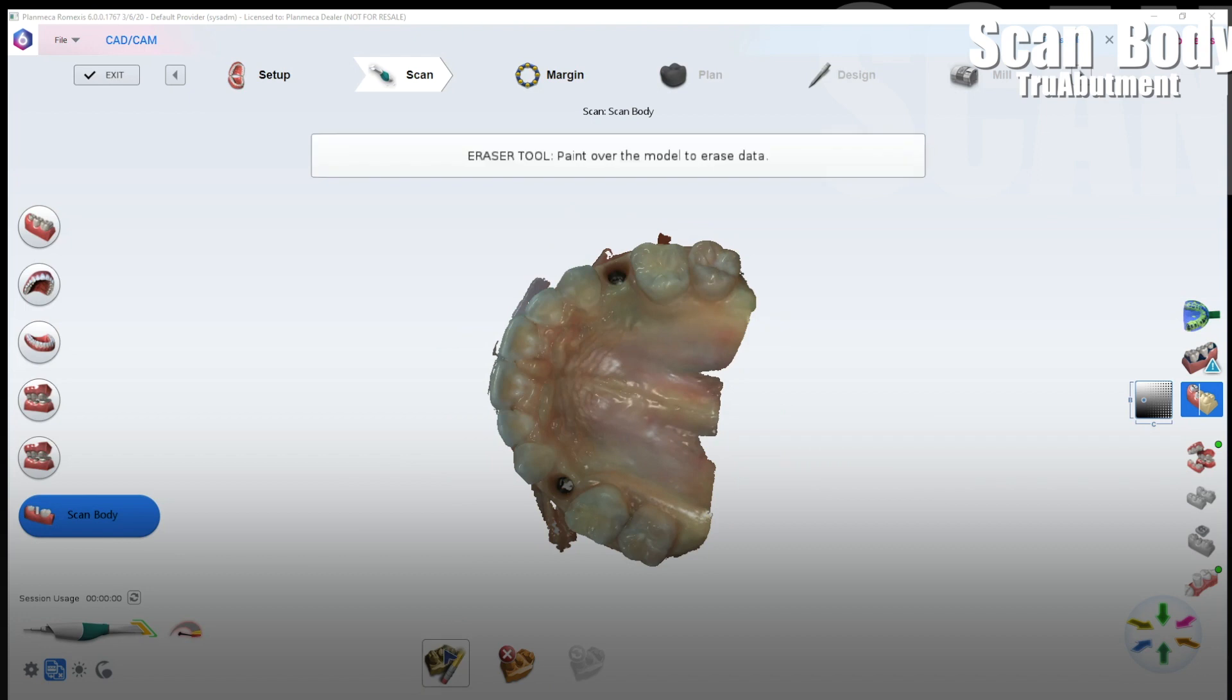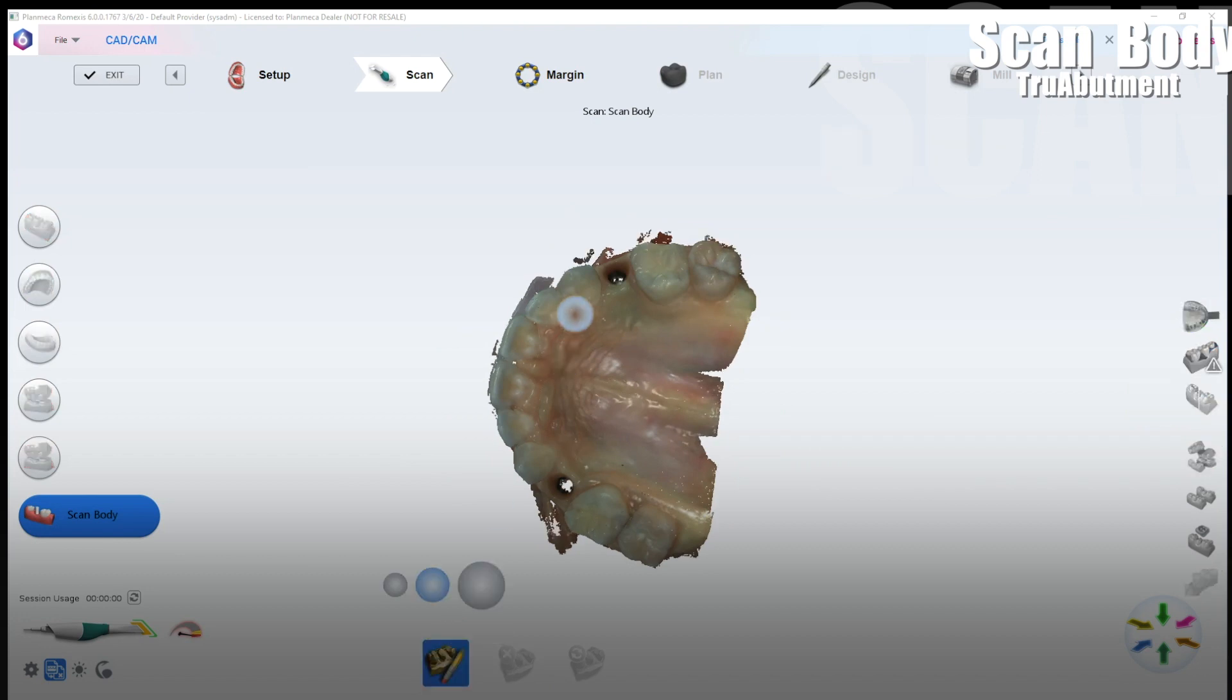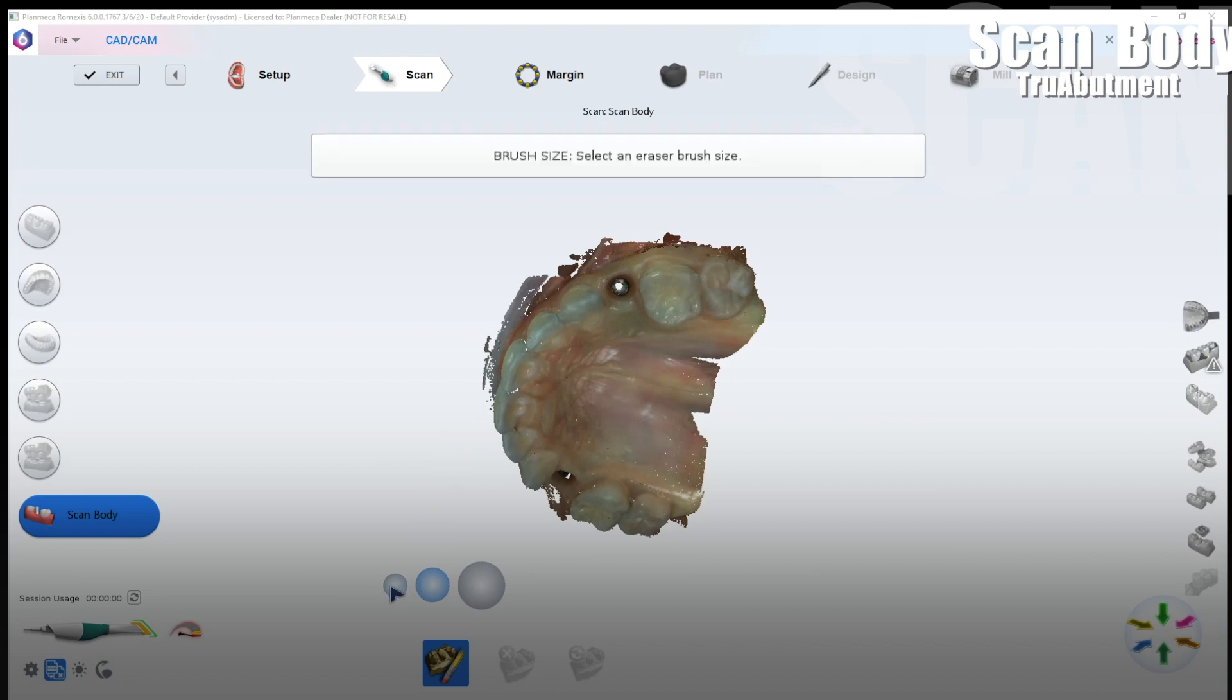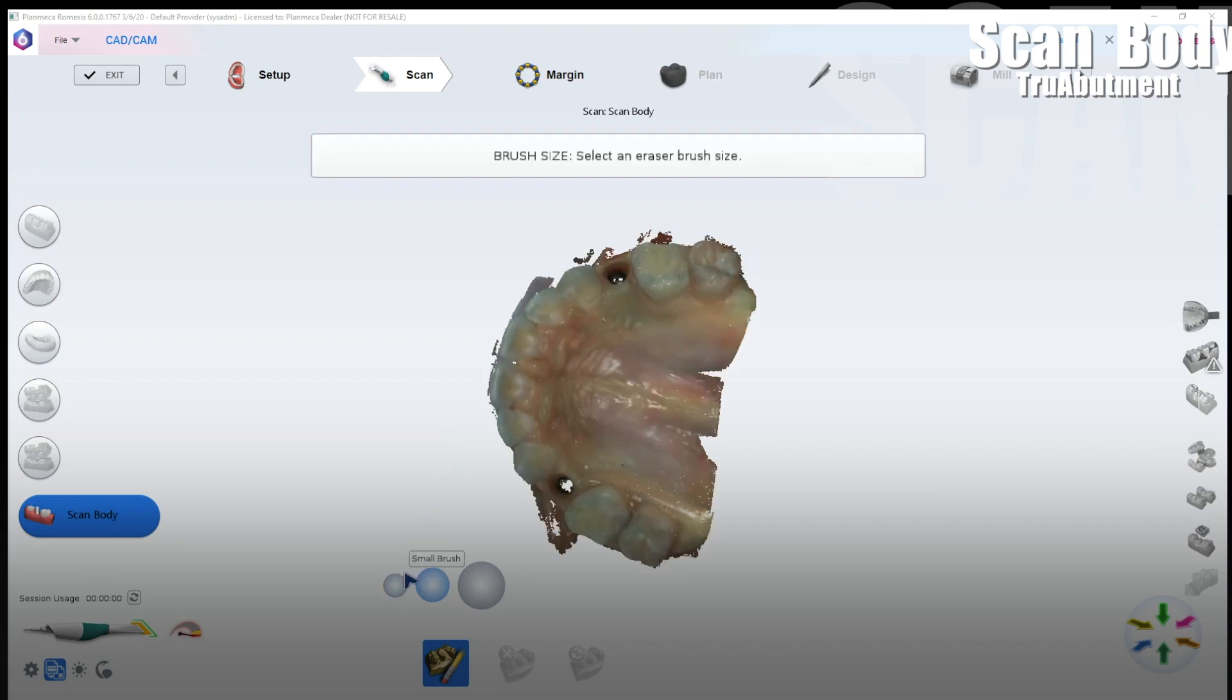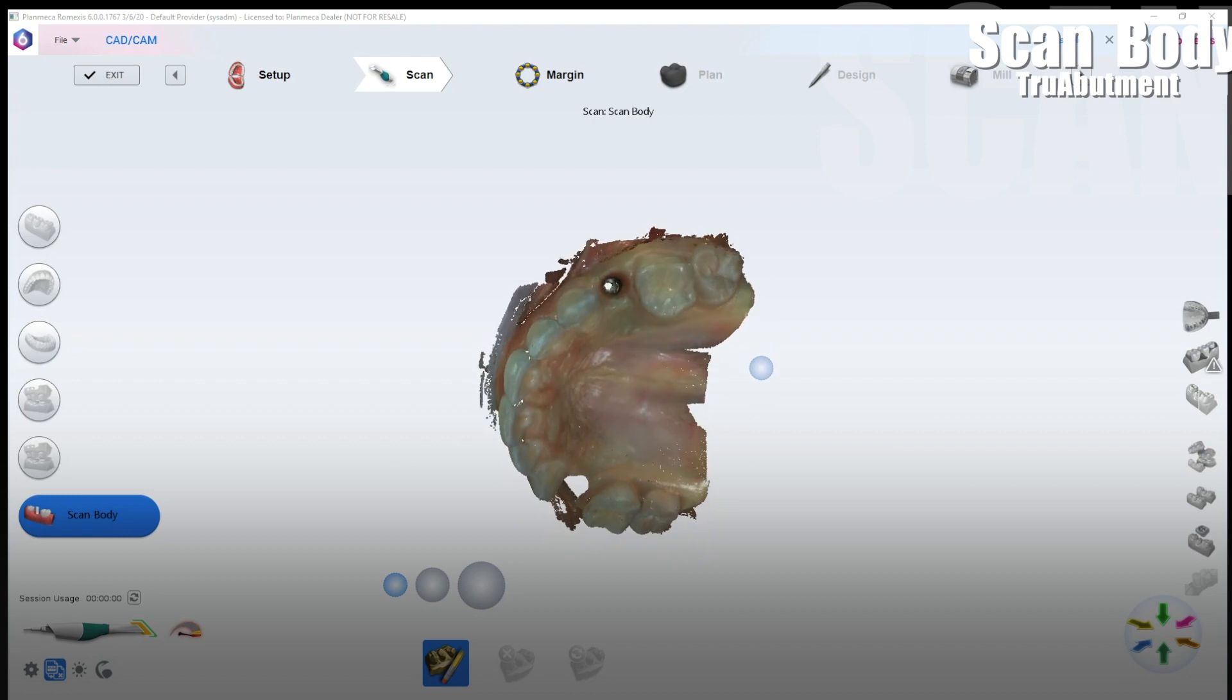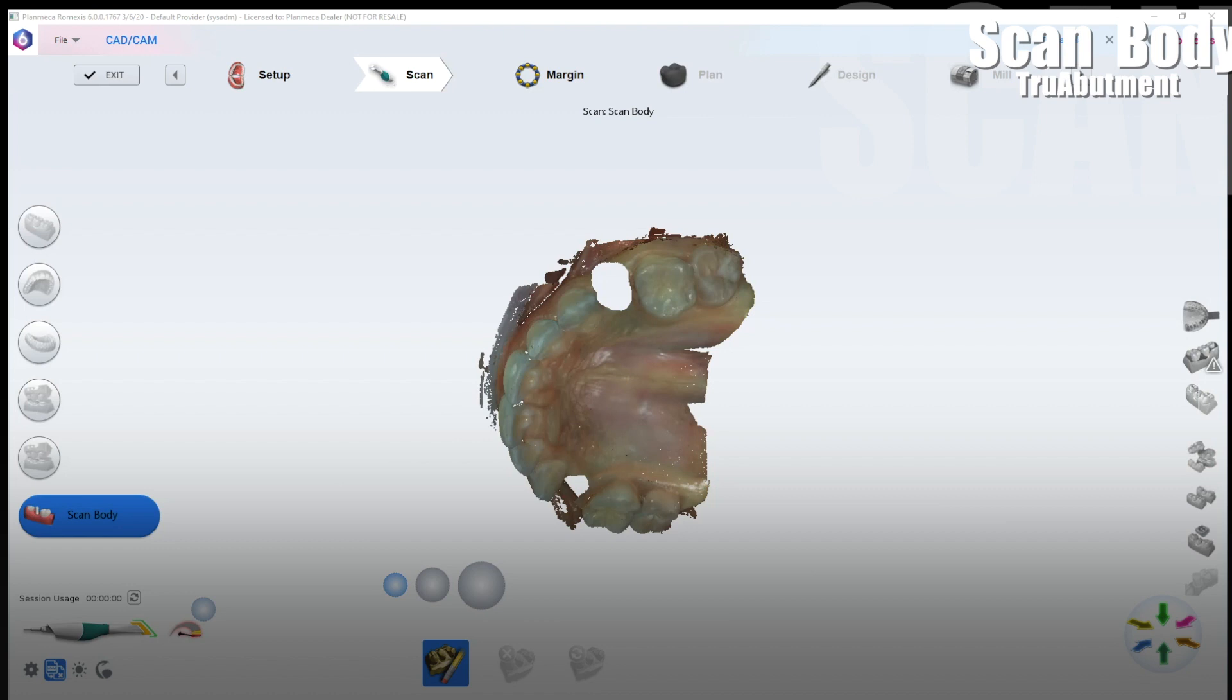Alright so now we're going to go to the scan body tab and it asks me do I want to copy my maxillary scan into the scan body tab. The answer is always yes. And what you need to then do is delete just a little extra of the soft tissue around the gingival scan of that implant site. So here I'm just using the eraser tool and going ahead and I'm deleting a little bit extra around there. And that's so that you get a good stitch of that scan body in that site without it having a previous scan interfere with that merge.